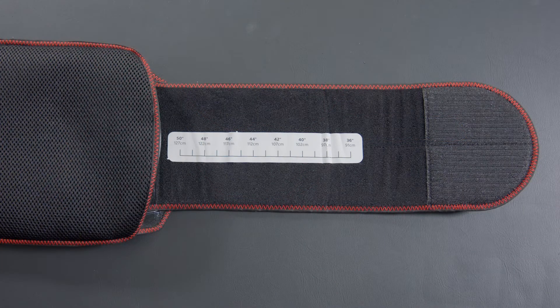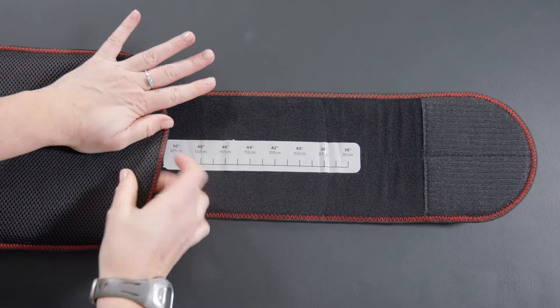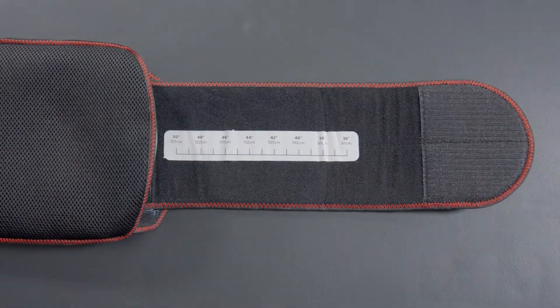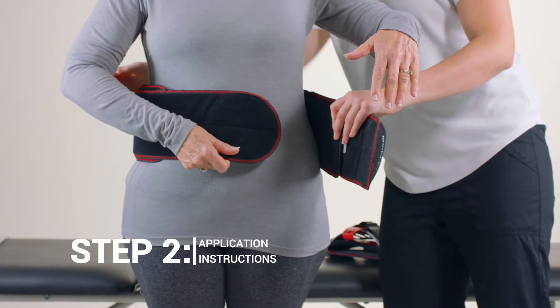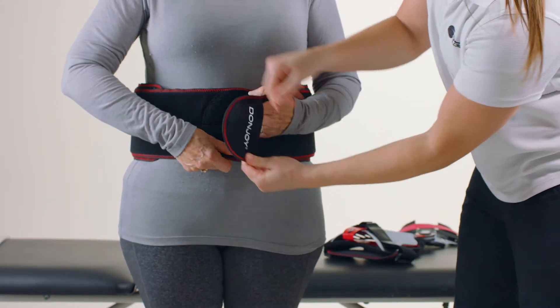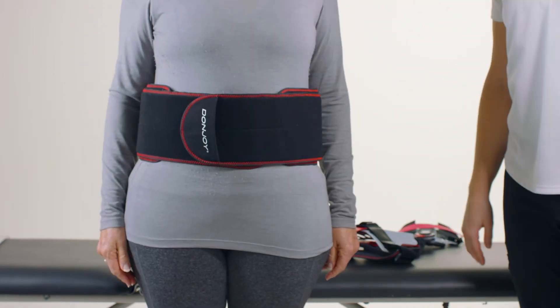Note: for patients with a waist over 53 inches or 135 centimeters, an extension belt is included in the packaging. Wrap the waist belt approximately one inch or two and a half centimeters above the widest part of the hips and secure the hook and loop attachment on the front side of the patient.